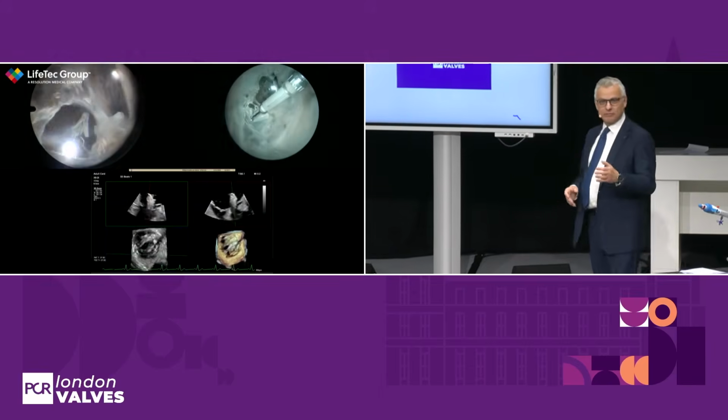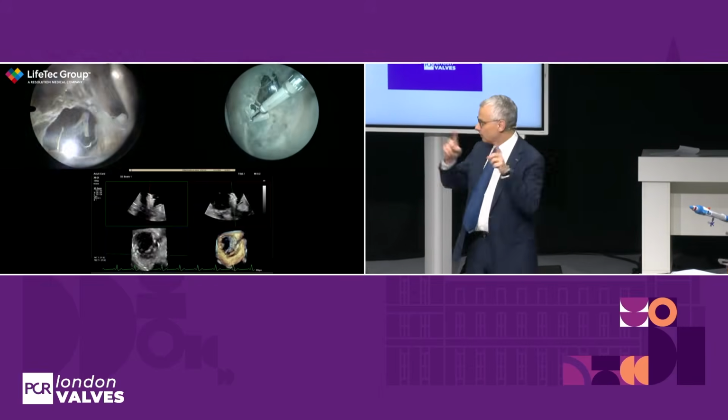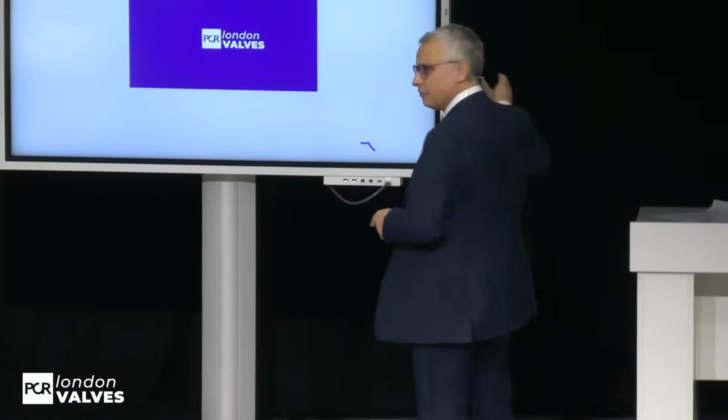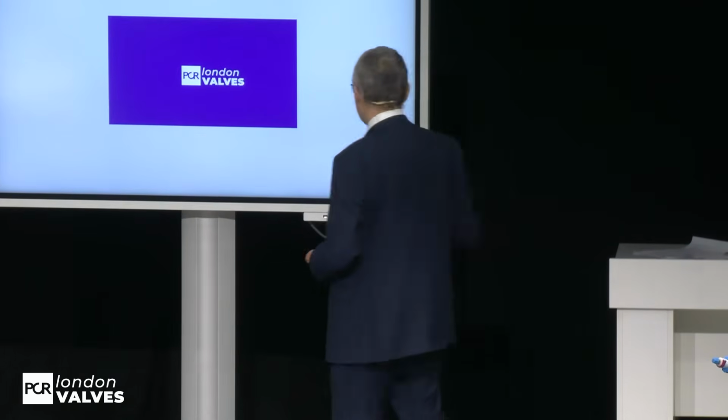First of all, there is also a third group of people here that probably don't know what we are talking about. Should we clarify? What do you think? I think it's a good idea.